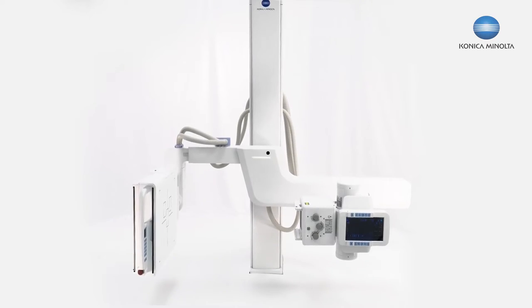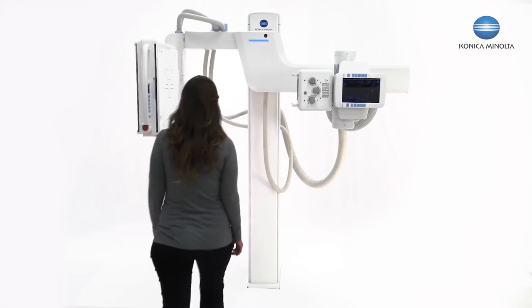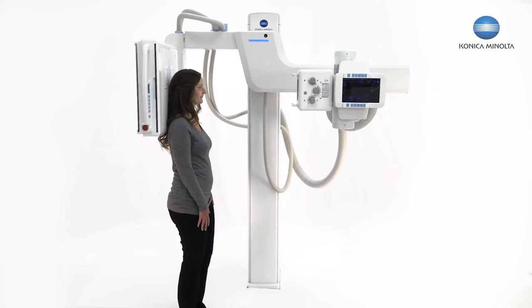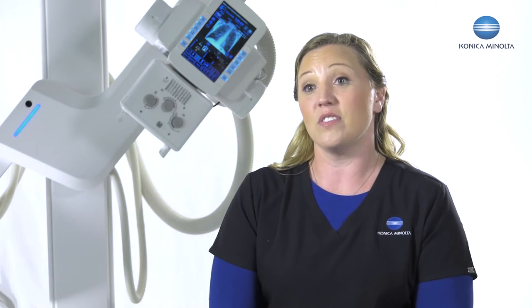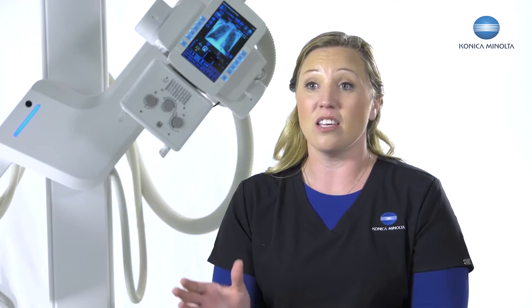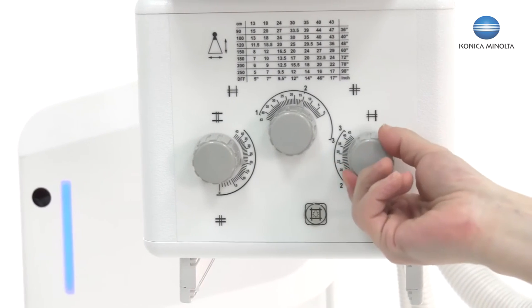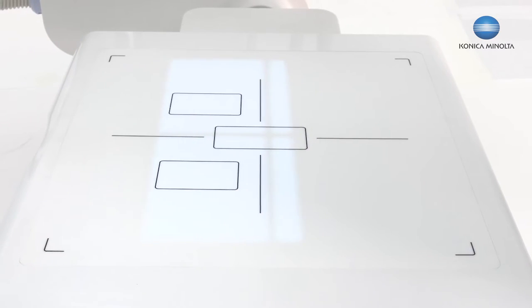Another great advantage of the third generation U-Arm is that I have a smaller enclosure size. This is awesome — I can bring the detector down close to the ground for easy access for the patient. Even though I have a smaller enclosure size, I still have 17 by 17 detector technology inside. We also have a three-knob collimator, so I can do my sunrise knee or any off-center imaging and collimate right down to that area, which helps for scatter and image quality.